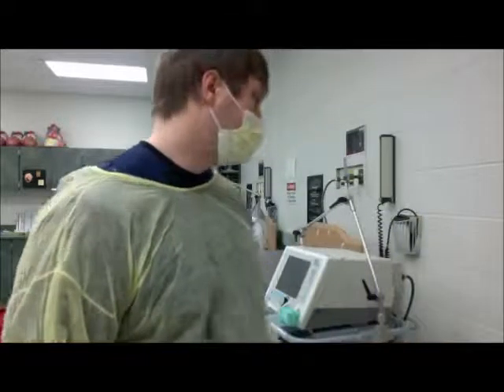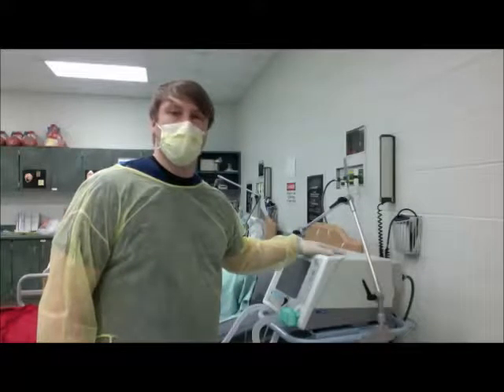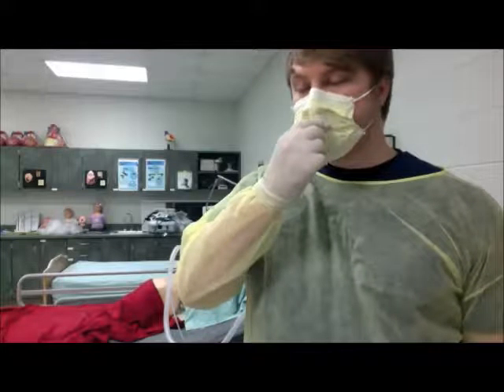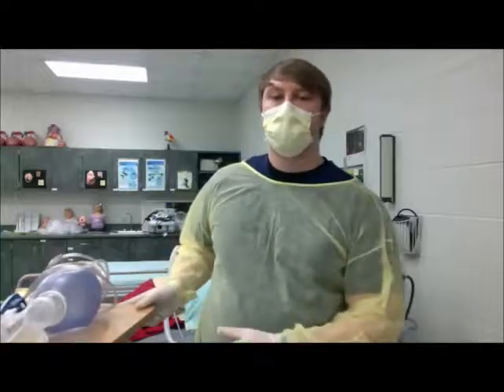We called rapid response, but to be honest, this should have been called right after she was extubated and found out that her respiratory status was decreasing rapidly. So while I'm waiting for rapid response, things I need to do is I'm going to continue to do my patient assessment. I'm going to make some vent changes on the BiPAP if need be to help with the comfort levels and the decreased work of breathing. Also, I'm going to get the intubation equipment ready along with some of the drugs, the paralytics, and the sedatives.